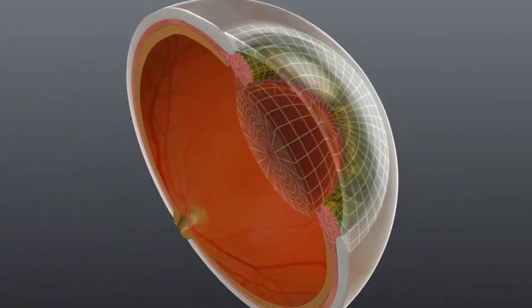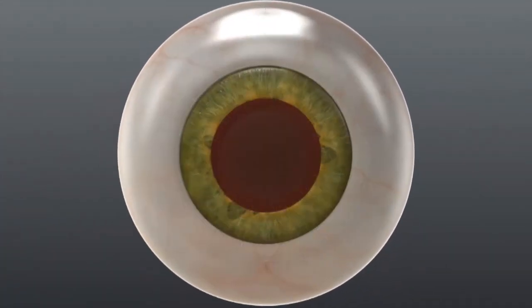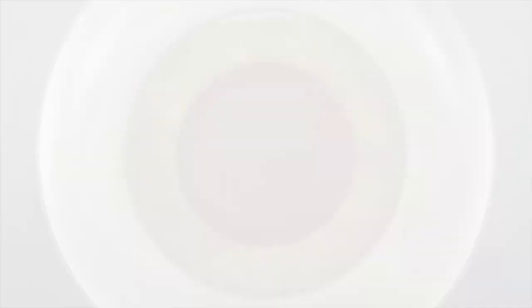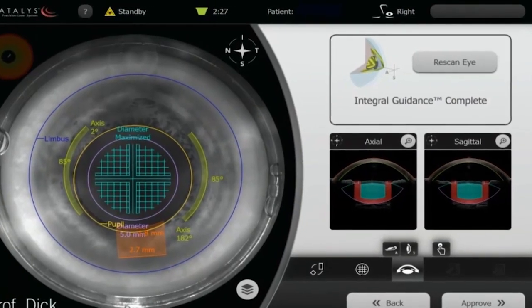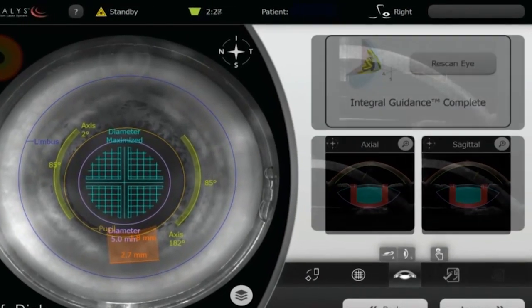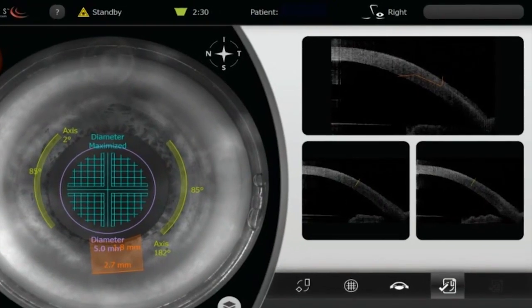What this means is we can capture the full three-dimensional image of the eye, which allows us to recognize any tilt of the lens automatically. The surgeon doesn't have to go in and do anything manually. They simply confirm the recognition of the features are correct and approve the treatment plan. It's a much more elegant and simple way for the surgeon to complete the procedure.